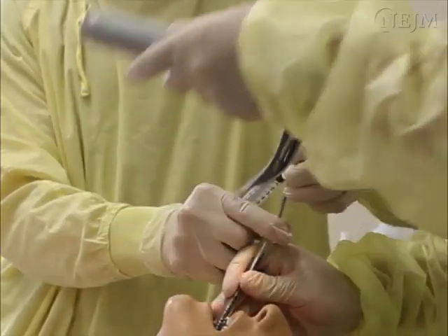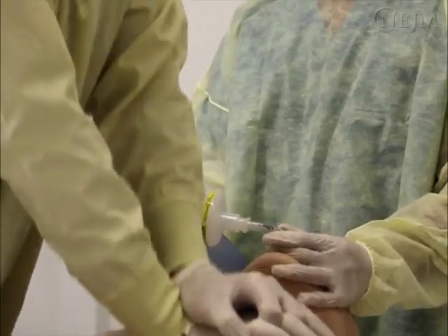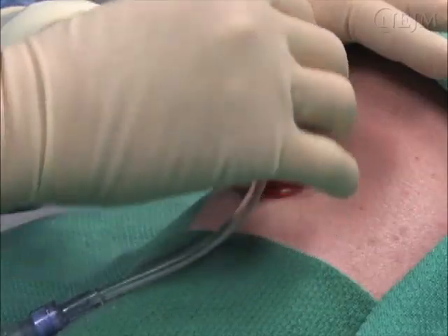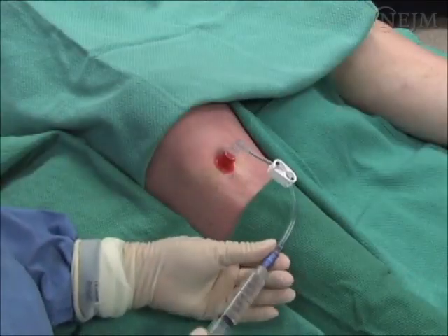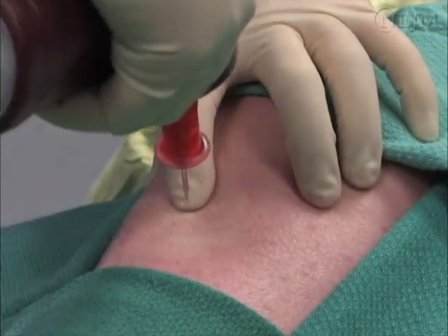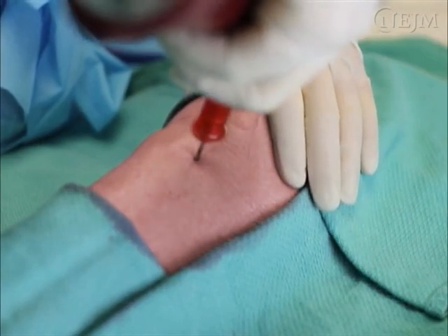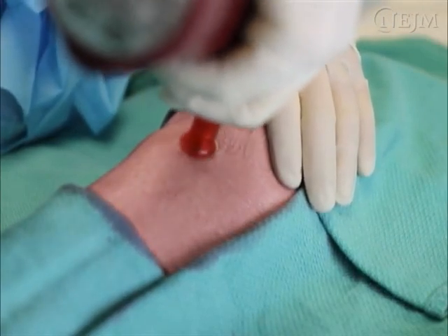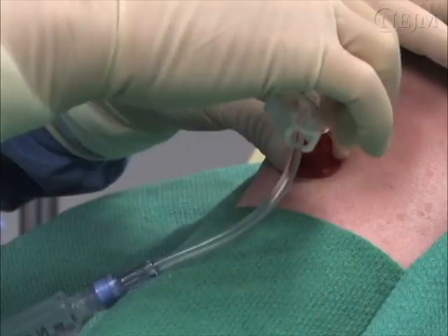Obtaining rapid vascular access is an essential step in the resuscitation of critically ill patients. The intraosseous route provides vascular access quickly and reliably when peripheral and central venous routes are unavailable or have failed. Although the insertion of an intraosseous needle was originally performed in pediatric resuscitations, this method has gained acceptance for use in adults, especially since the advent of mechanical insertion devices.